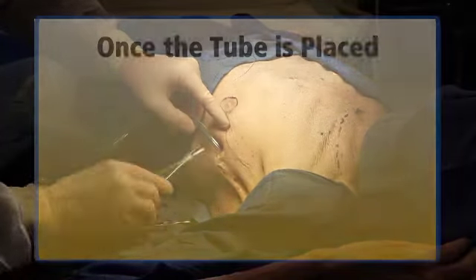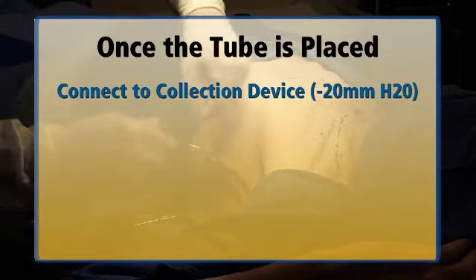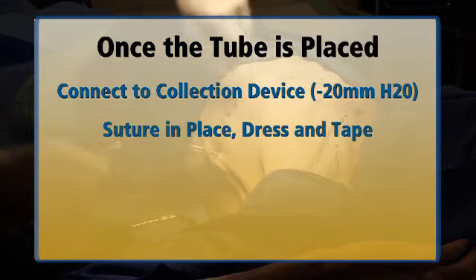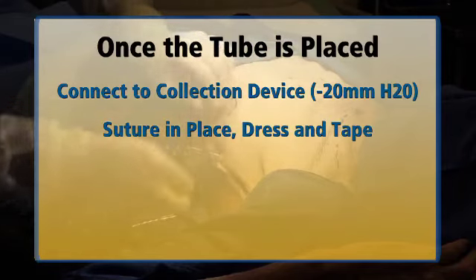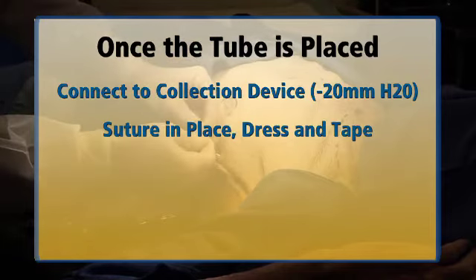Once the tube has been placed in the chest, the remaining end should be connected to an underwater seal collection device and hooked to suction. The chest tube is then securely sutured in place, covered with an occlusive dressing, and taped to the chest wall.